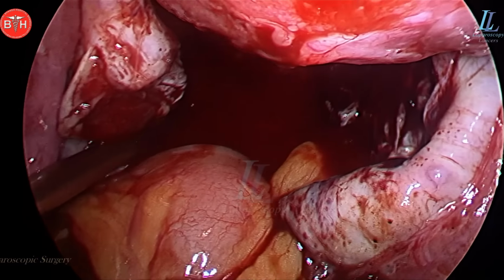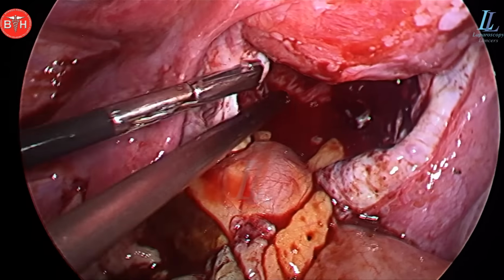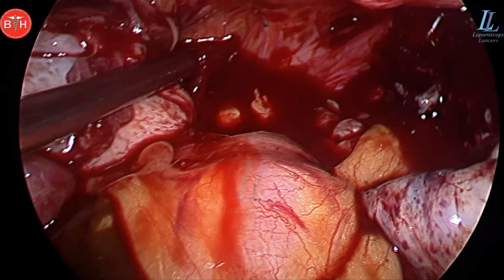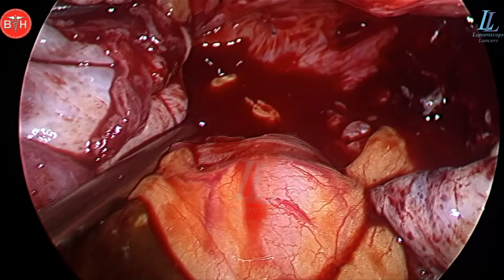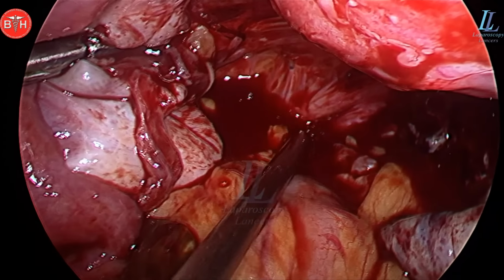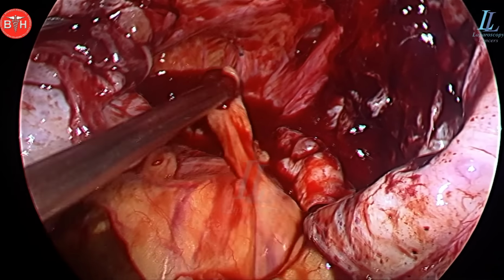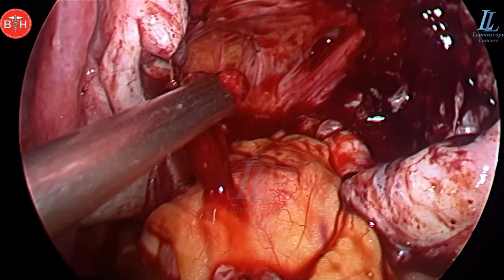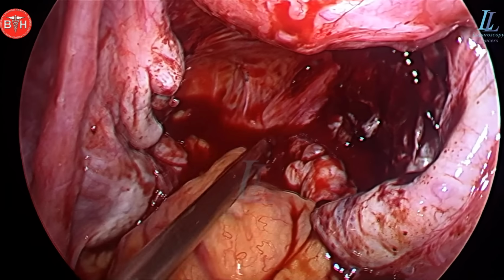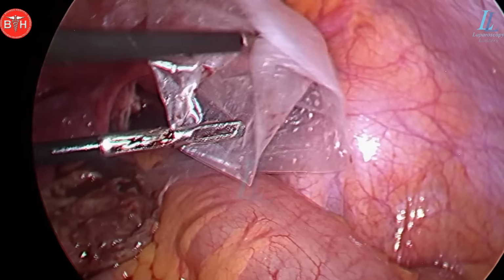That's the blood, you can see clotted blood. If there is no pink blood, that means no issues. And you must have noticed that other than cutting the ovaries, the initial incision, I have not used any thermal injury over the ovaries. No thermal things for hemostasis, as generally most of the people tend to do carpet bombing over the ooze. So please do not do any carpet bombing over the ooze. Let the body handle it.